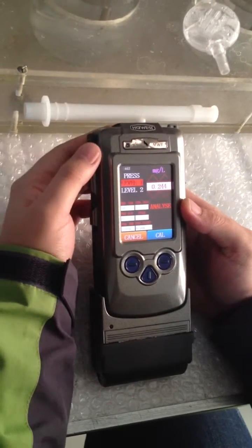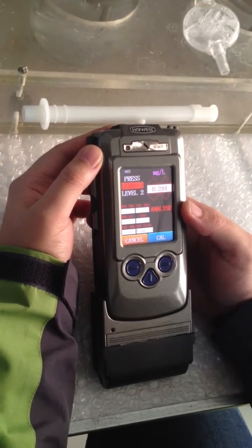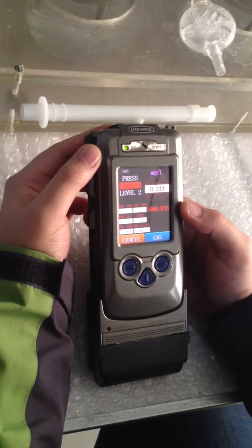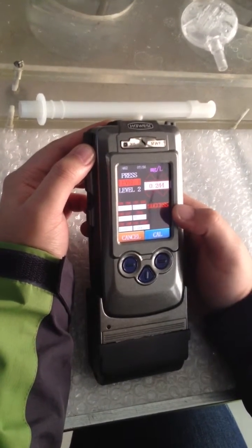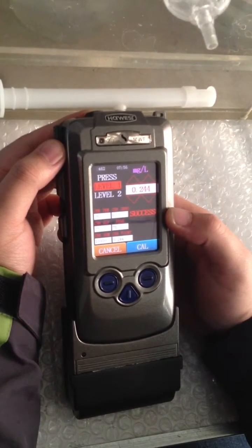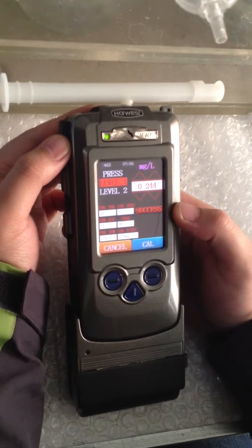The breathalyzer is now starting to sample. Success. The first point for alcohol calibration is successful.